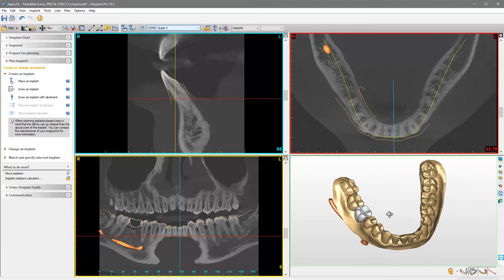In the 3D window, left-click the region where you would like to add the implant. In this way, Simplant Pro will show you the corresponding slices in all 2D view windows.